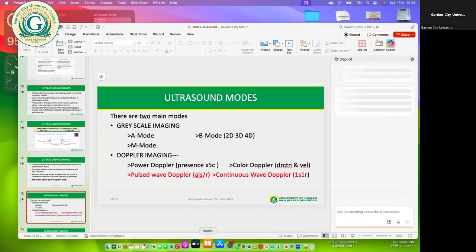But I don't think that any of these modes would give you as accurate a result as the ultrasound M mode is going to. Because first and foremost, if you use the fetoscope, you may be hearing the activity of the abdominal aorta of the mother, which may be interpreted as the fetus's cardiac activity.